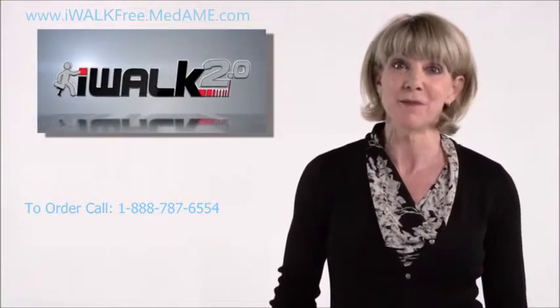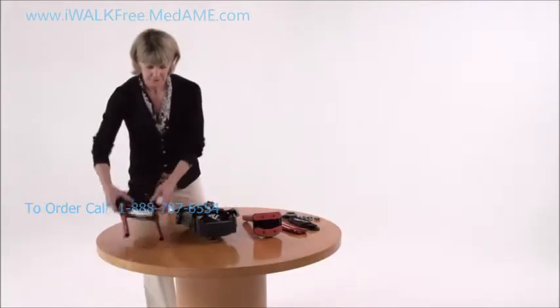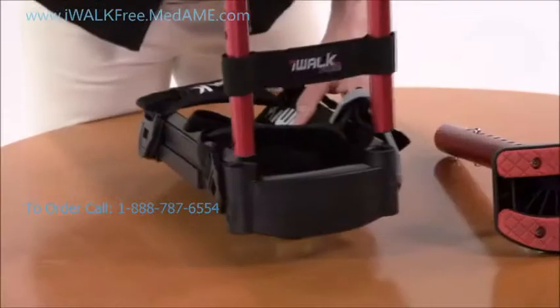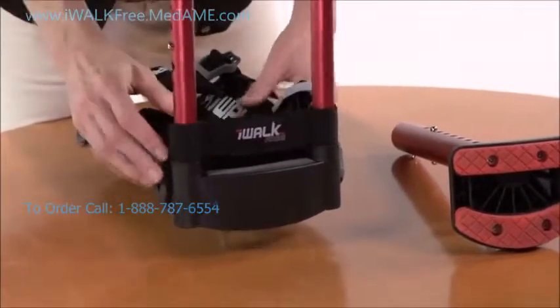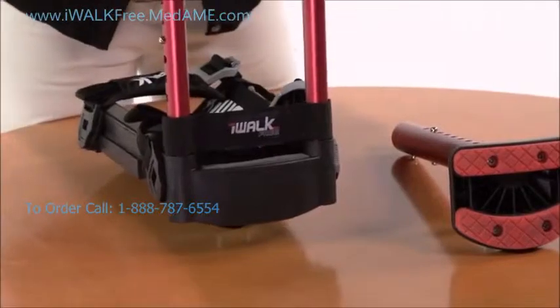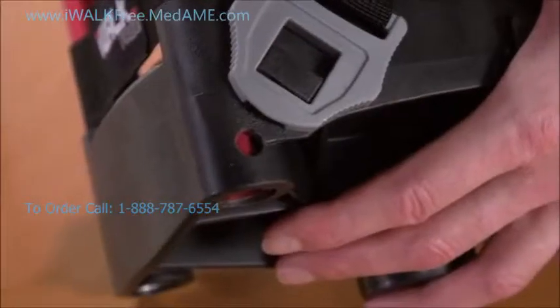Now that we've identified the parts, it's time to assemble your iWalk. Start by putting the upper assembly into the middle assembly. Make sure the handle is facing forward and just slip the two tubes into the sockets of the knee platform. See the holes near the bottom of the sockets on the left side — you might need to rotate the lower tube to get them to line up.